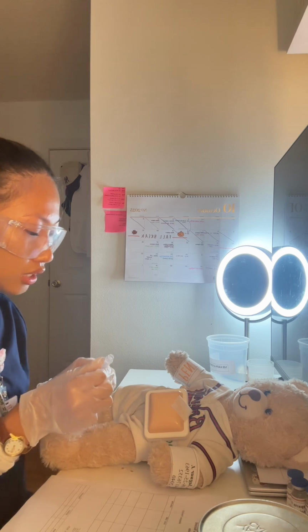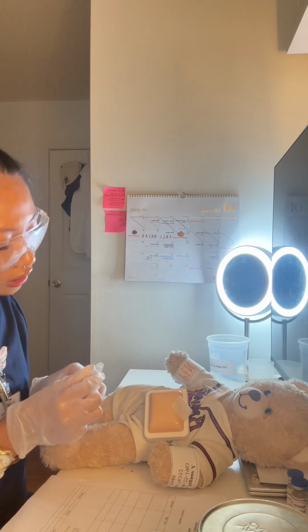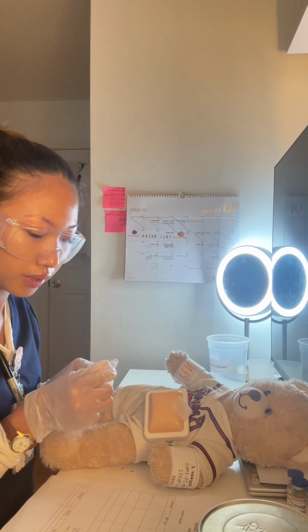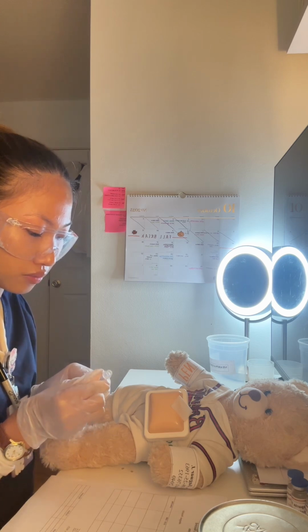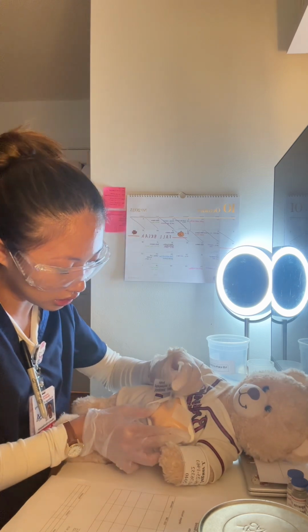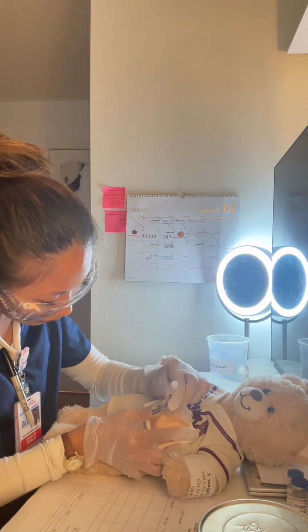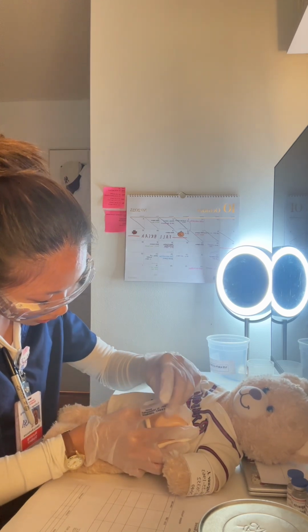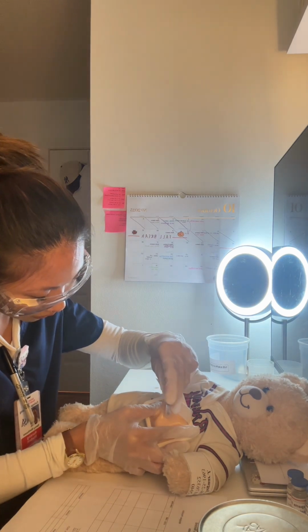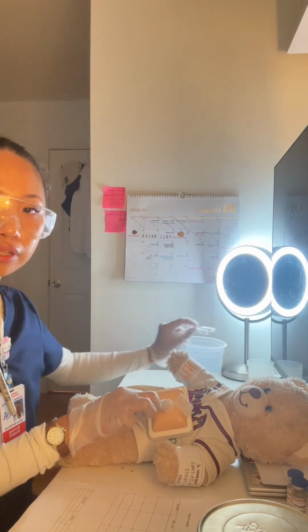And since this is a subcutaneous injection, I will grab 2 inches of the skin for a 90-degree injection, or I will grab 1 inch of the skin for a 45-degree angle injection. So go ahead and get that. All right, Mr. Jones, it will be just a slight pinch. So I'll pinch 2 inches of the skin. All right, go ahead and give it a 90-degree angle. Go ahead and check this slowly. All right, I'm gonna go ahead and place it in my sharps container.